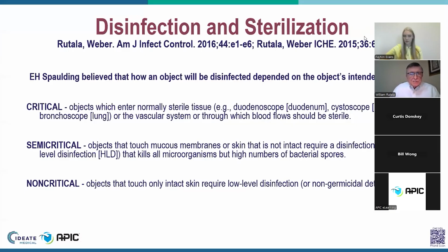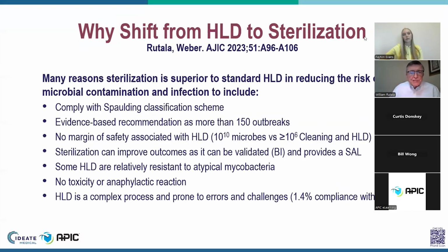In the next slide, we're going to look at some of the reasons for essentially transitioning from high-level disinfection to sterilization. And there are many reasons. First of all, we can comply with the Spalding classification scheme. Second, you can see there, it's evidence-based. It's based upon the fact that we have had more than 150 outbreaks associated with flexible endoscopes over the last several decades.